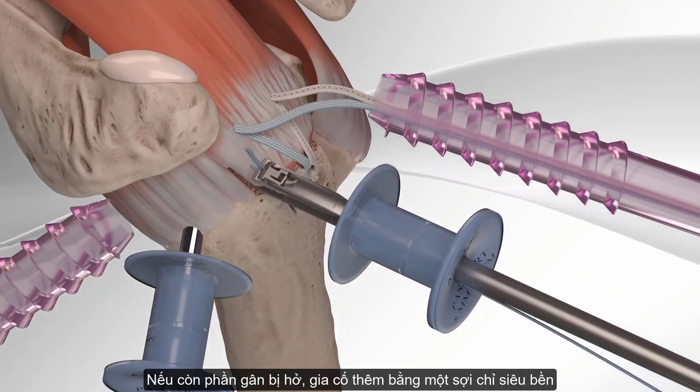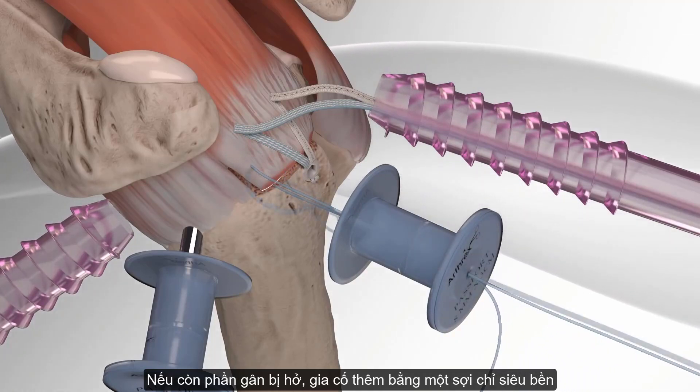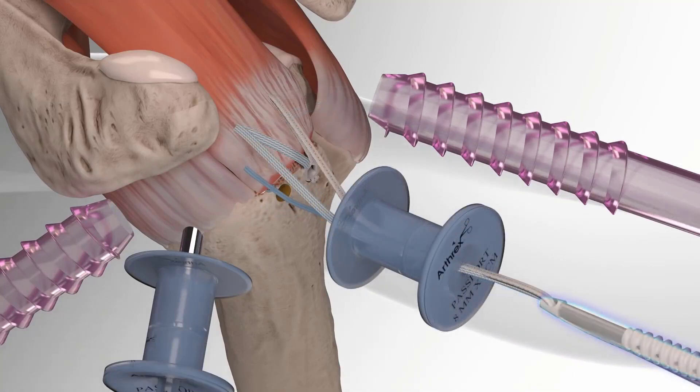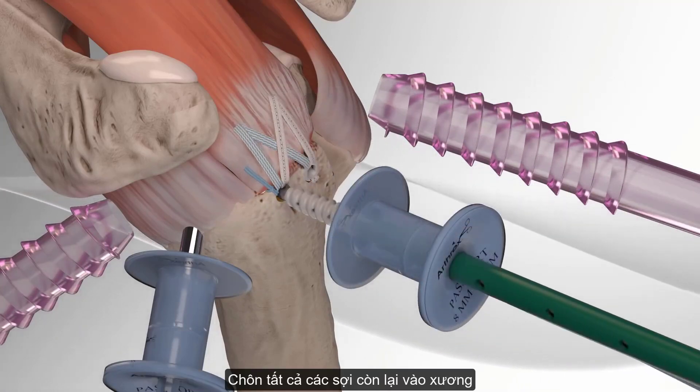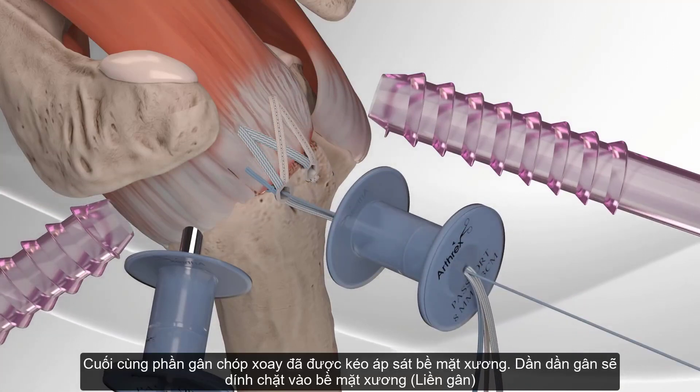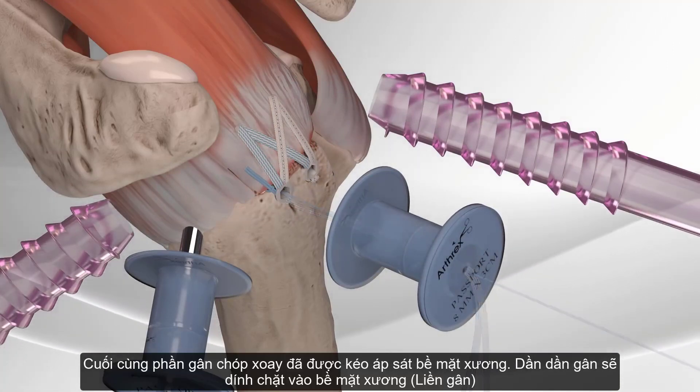Finally, if there is a loose end of rotator cuff, it can be secured with a fiber link and the two remaining fiber tape tails with a fourth and final swivel lock anchor. This completes the Speed Bridge repair.